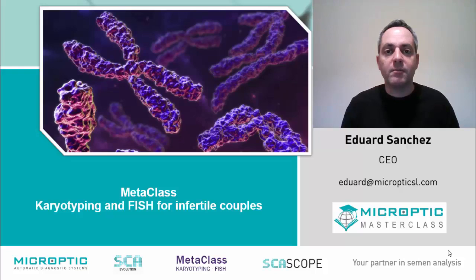Today I will talk about the MetaClass system, and I will explain why and how to use this karyotyping and FISH for infertile couples. You will find a button on the top of your screen where you can write your questions, and at the end of this presentation I will answer all.